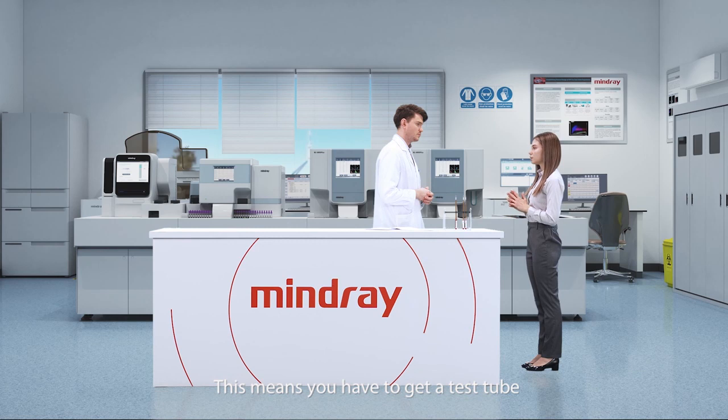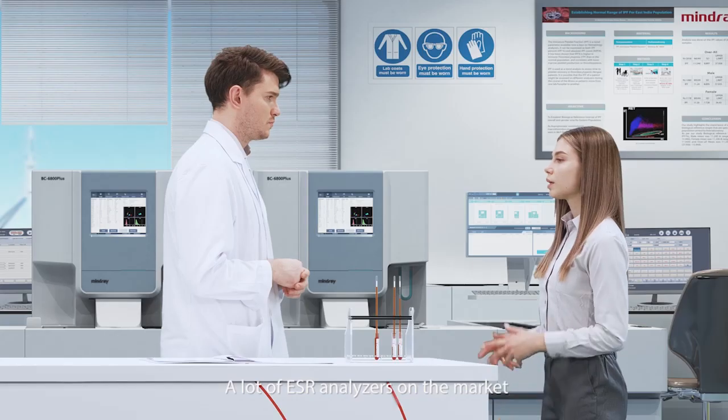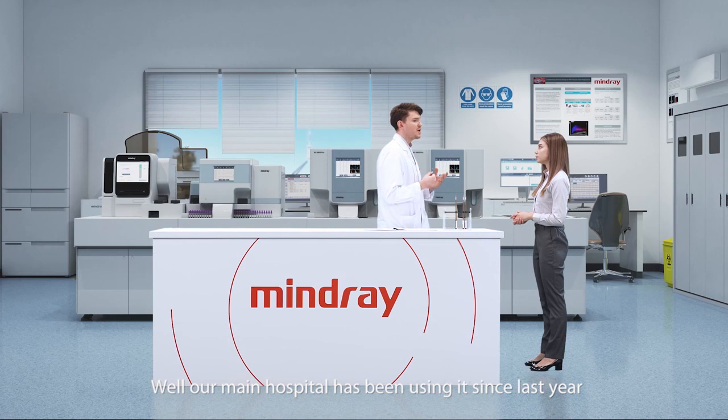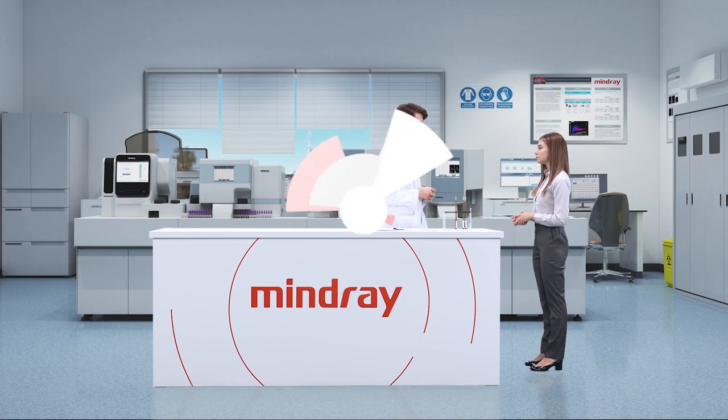This means you have to get a test tube after the routine CBC test and then perform the ESR test. It sounds tedious. And it takes a lot of time to wait for the result, almost more than 1 hour for each sample. A lot of ESR analyzers on the market can give you a fast result. Why don't you just upgrade it? Well, our main hospital has been using it since last year, but we are not satisfied with the result. And we don't have as many samples as there, so we just keep the manual method right here.